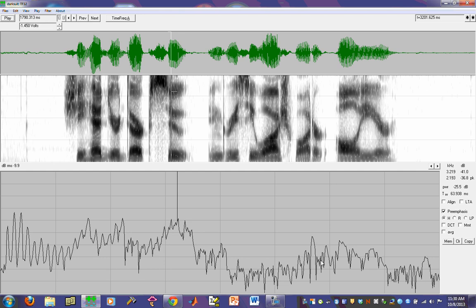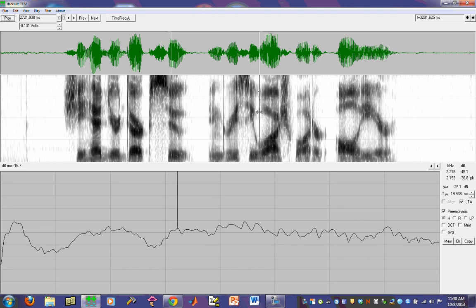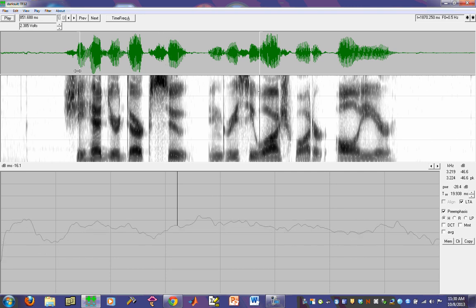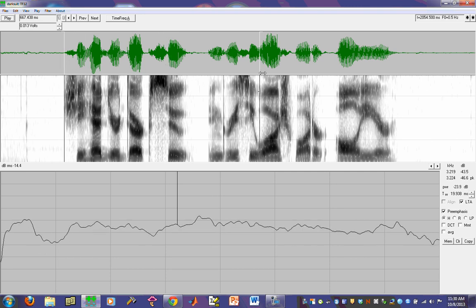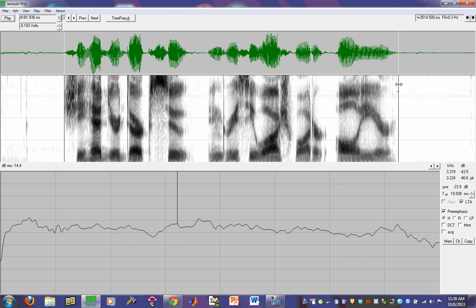Now, you can do both measurements of short-term spectra, as we've been seeing, but also a long-term average spectrum by clicking on this checkbox here that says LTA. And what that will do is it will generate the long-term average spectrum between two cursors. So what you can see here is what we're doing is we can maybe set this cursor at the beginning of the speech signal, and this at the end. What we're looking at here is the long-term average spectrum for that particular speech signal.